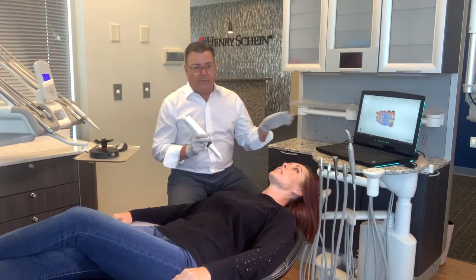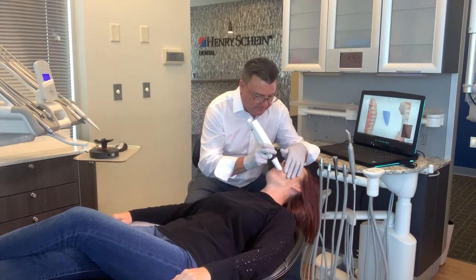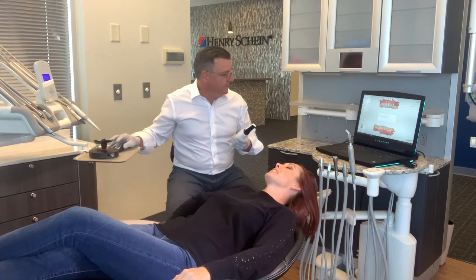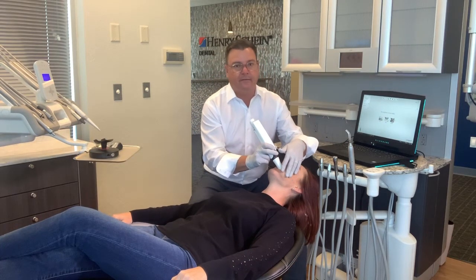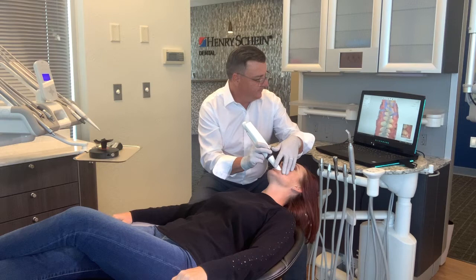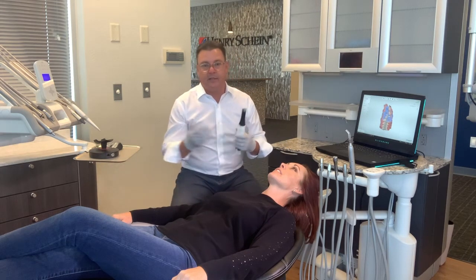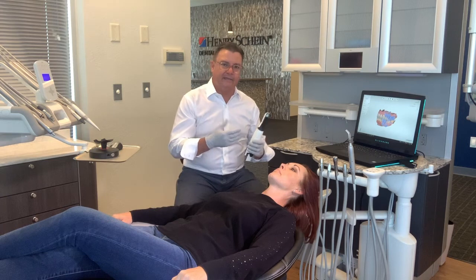Without touching the keyboard again, I'm going to go ahead and turn the scanner back on and start that second bite. Actually, I made a big mistake there — what I needed to do was not turn the scanner on yet. I needed to have her open, then retract the cheek, and then bite. What happened was it started scanning and it had caught a piece of the tongue, so it couldn't continue scanning the bite. All I had to do was clear the scan and move on. None of these things are a big deal — you just need to be trained so that you know how to get past them quickly and efficiently.